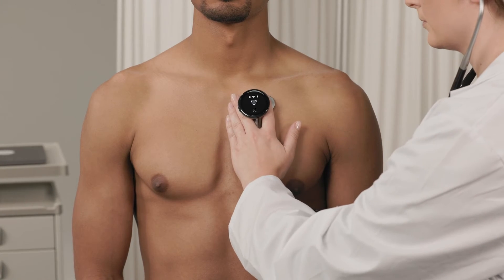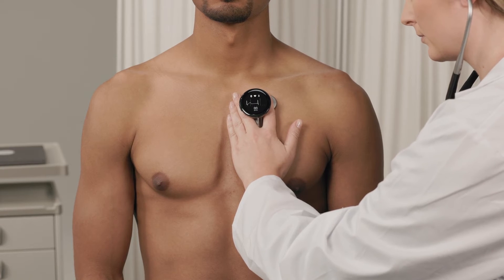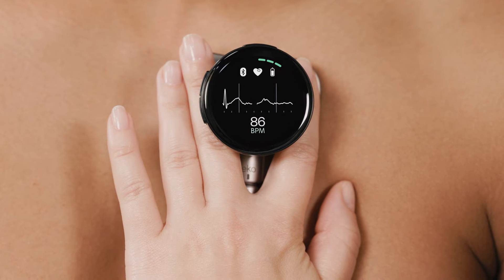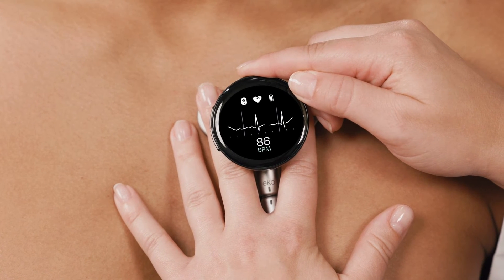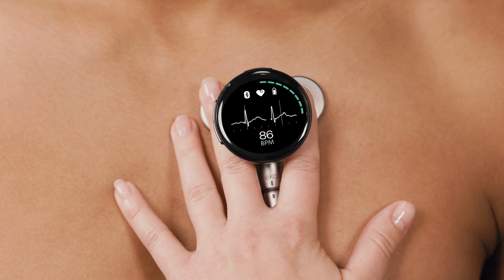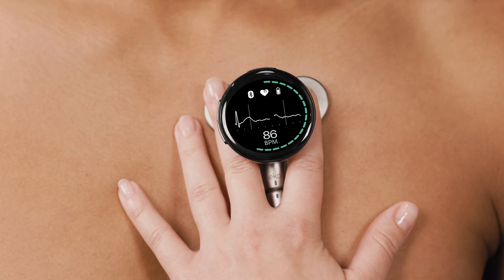Now you're ready to take recordings. Place the device on the patient. Recordings begin automatically if the Record Automatically setting is on, or press the top button for 2 seconds to start the recording. The bars around the screen light up green when recording is in progress — when you see these green bars, you can have confidence that the recording is working.